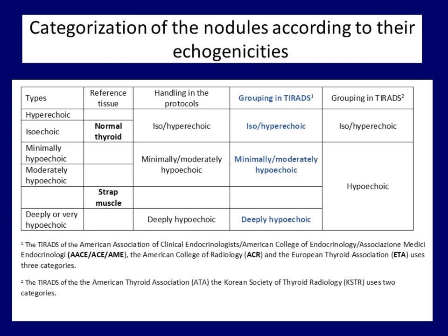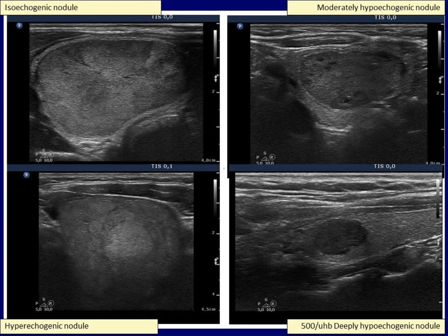Let's see some examples. The overall echogenicity of the left upper nodule is similar to the non-nodular part, so this is an iso-echoic lesion. The left lower nodule is brighter compared to the surrounding non-nodular tissue, therefore this is a hyperechoic lesion. Both right nodules are hypoechoic because they are darker than the extranodular thyroid. Compared to the strap muscle running ventral to the thyroid, the upper nodule is brighter while the lower is a bit darker. So the upper lesion must be regarded as minimally or moderately hypoechoic, while the lower one has a deeply or very hypoechoic pattern.